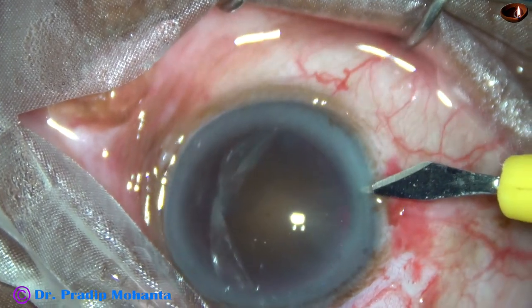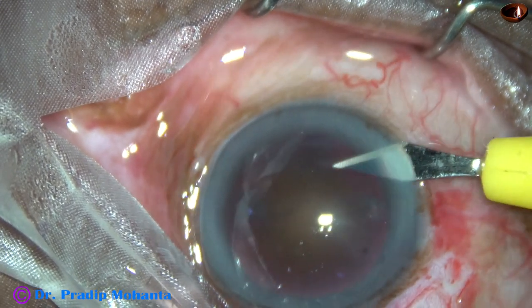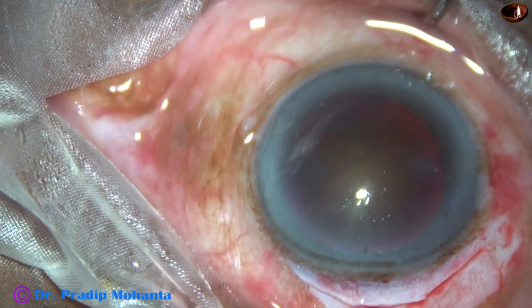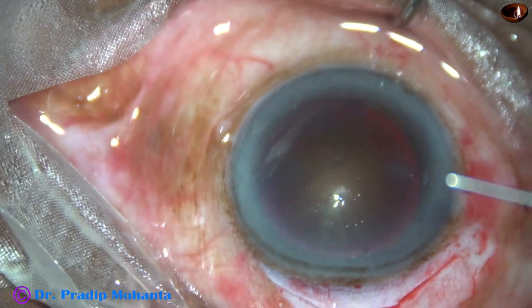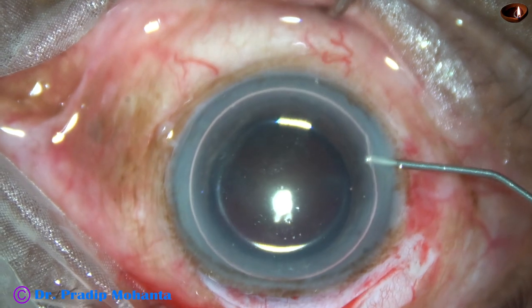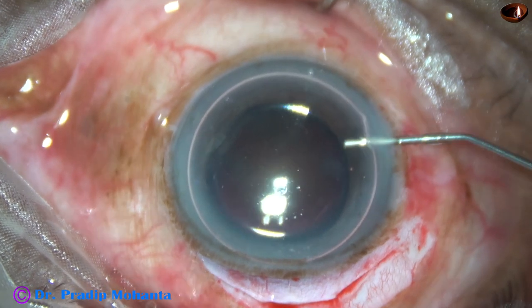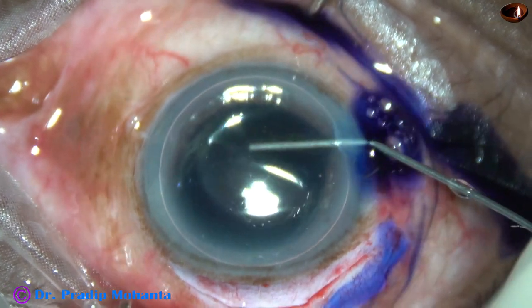Now this is the side port, between 8:45 and 9 o'clock. Now I am going to stain the anterior capsule underneath the air bubble — stain with trypan blue dye. Here goes the dye.